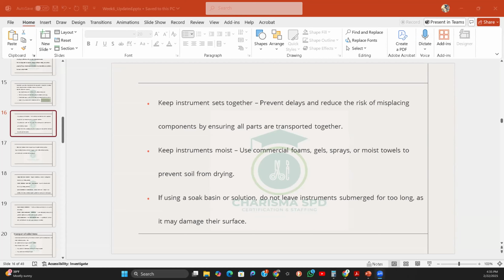It will result in improper processing of the instrument. Okay, it's not a bad idea, but it's not exact. Cross-contamination. It's an answer, but it's not what I'm looking for. Delays in processing. Fantastic. Delay. That's it. You want to reprocess A. Now the A items are in C. So you have to figure it out.